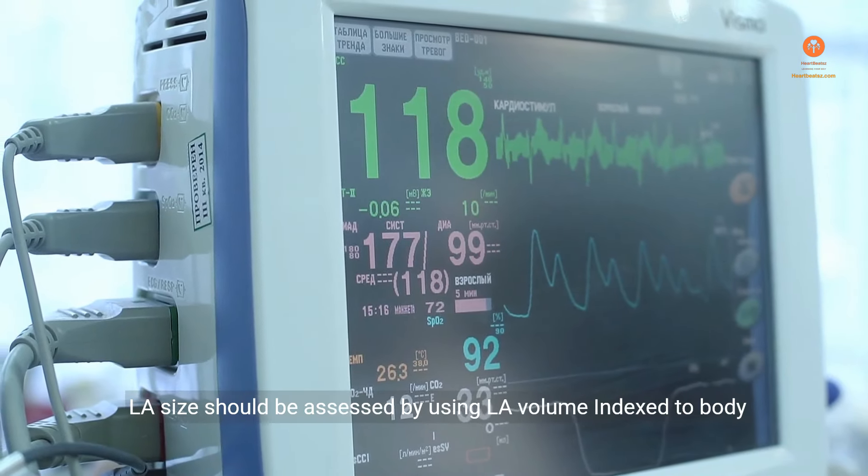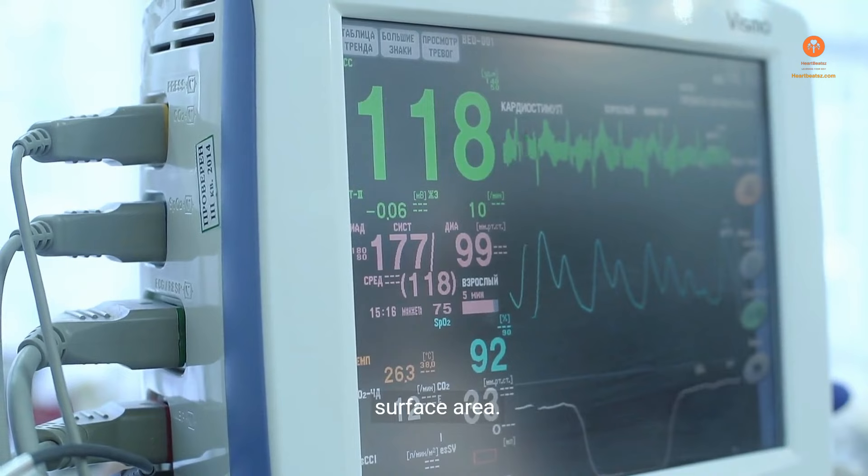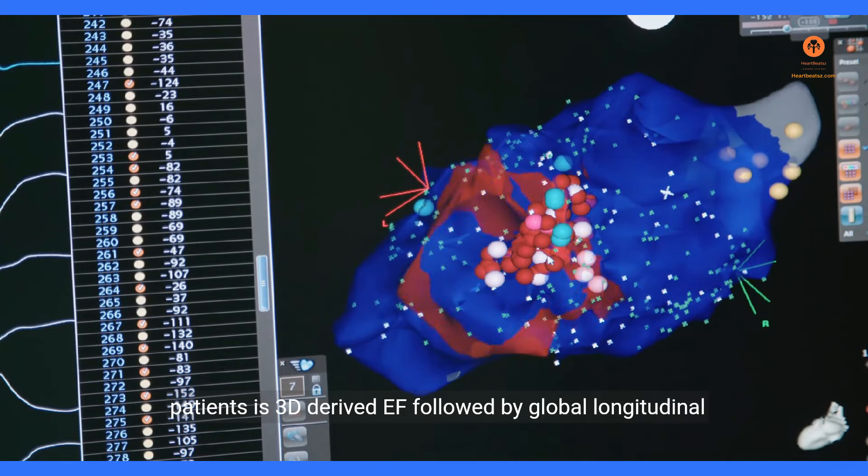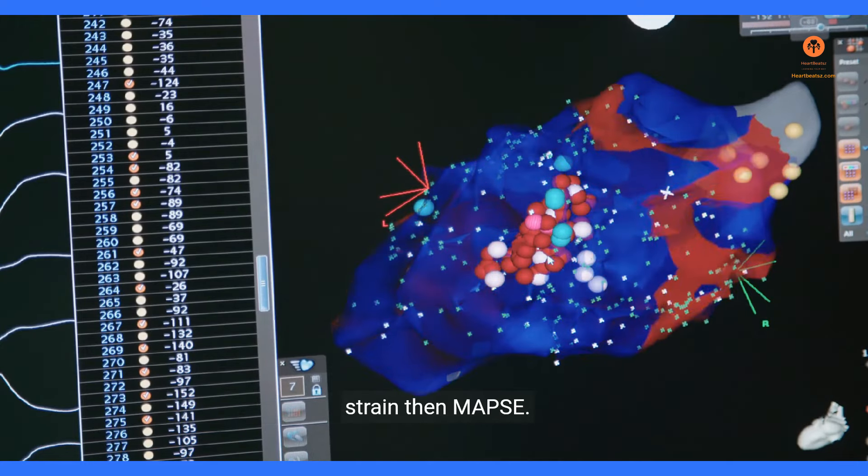LA size should be assessed by using LA volume indexed to body surface area. The recommended method for assessment of EF for chemotherapy patients is 3D-derived EF followed by global longitudinal strain, then MAPSE.